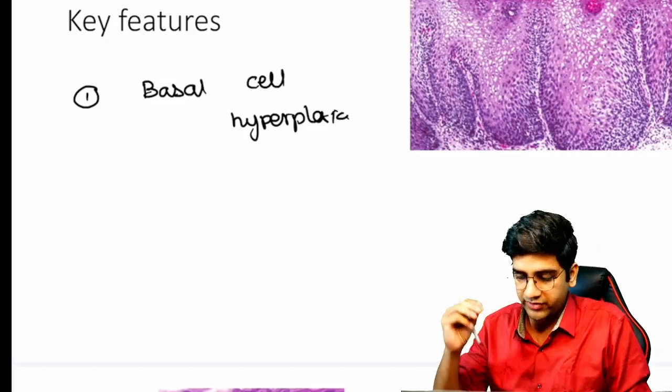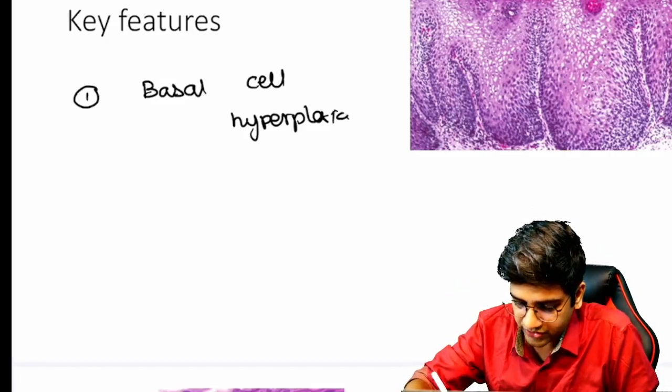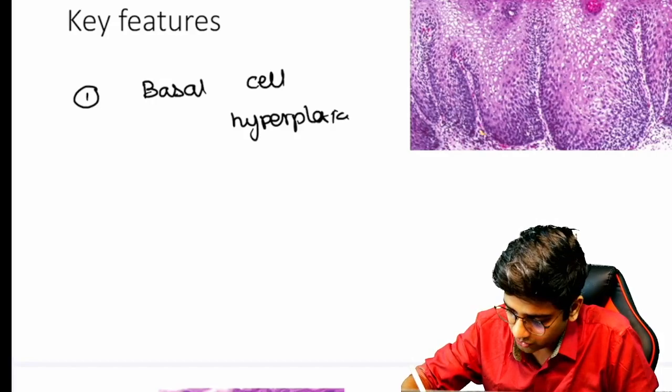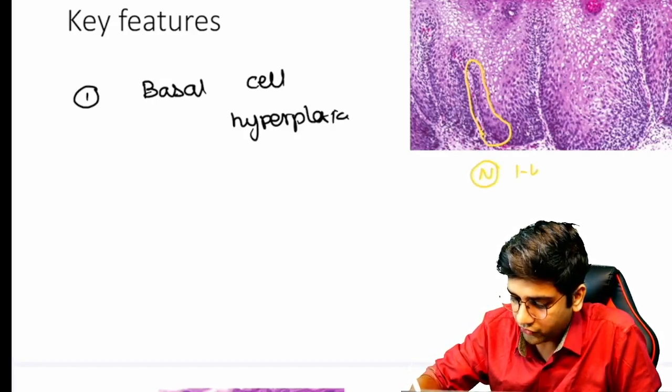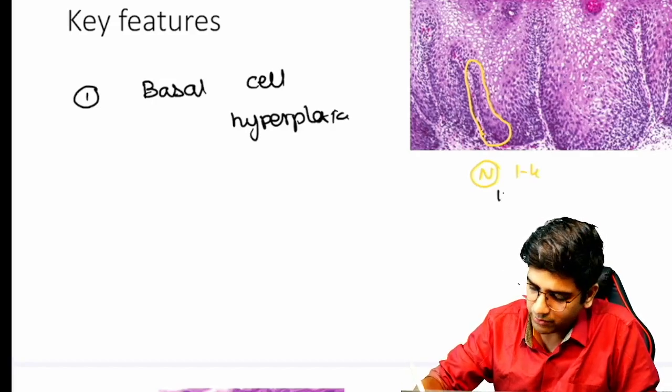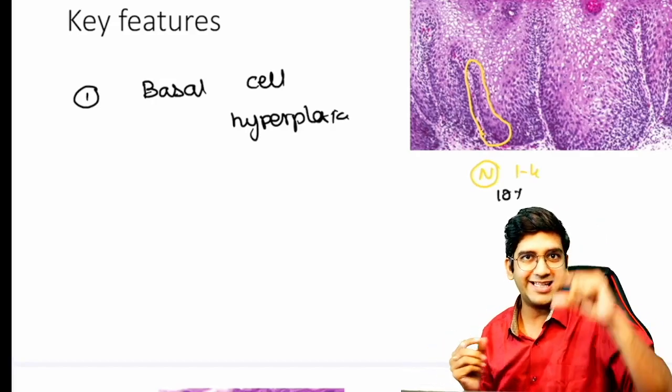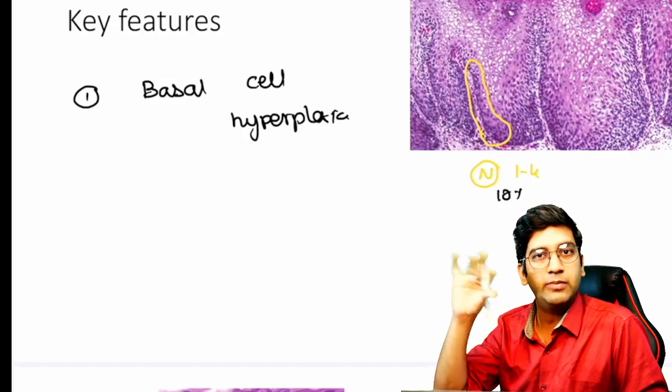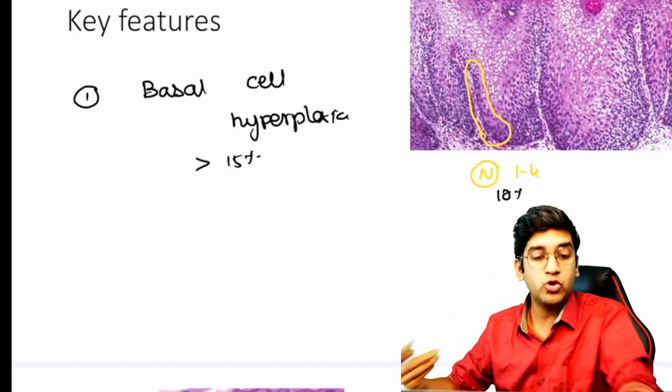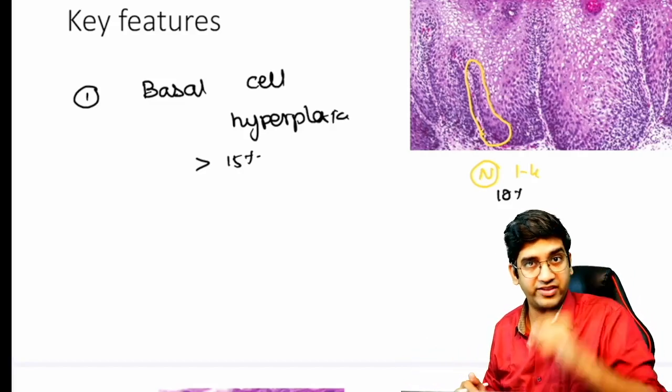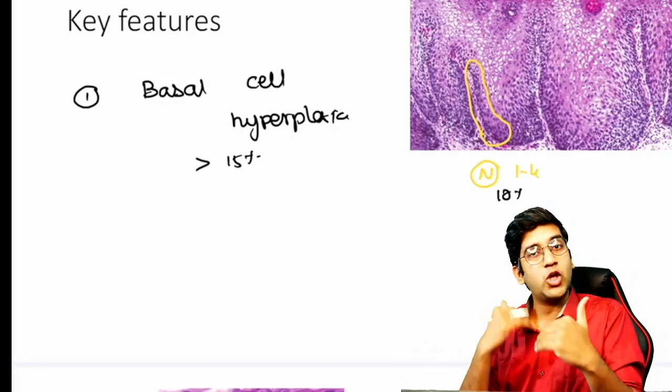When I take a normal basal epithelium of the esophagus, you can see here the normal basal epithelium. Normally it's around one to four layer thickness, or let's say approximately 10 percent of the entire thickness of the squamous epithelium of the esophagus. If it goes beyond 15 percent, I'm going to call that basal cell hyperplasia—beyond 15 percent of the thickness.